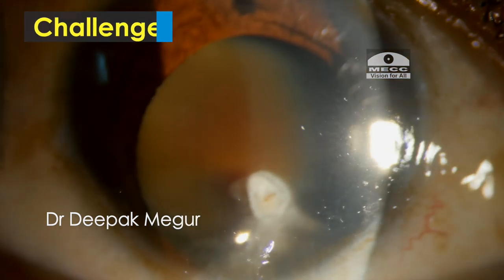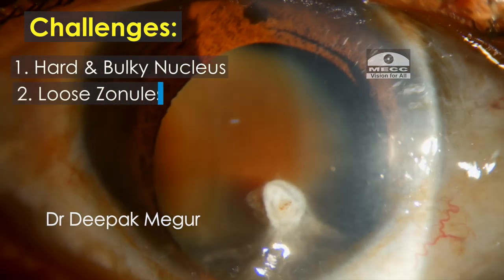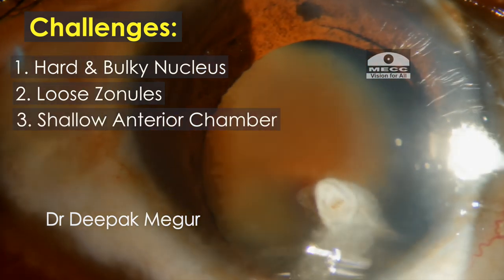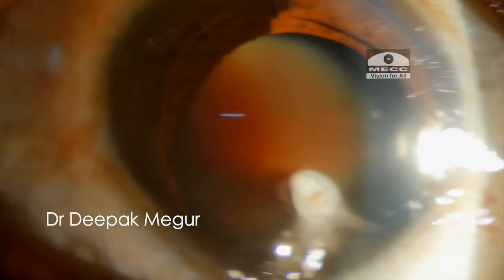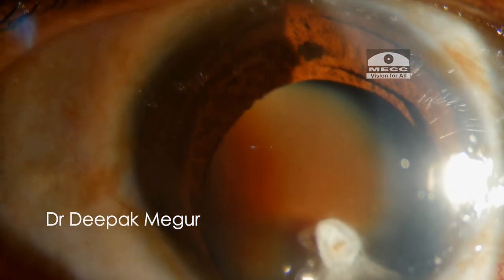So I have multiple challenges to deal with in this case. The lens is quite hard and bulky, loose zonules are to be expected, and we have a relatively shallow anterior chamber to deal with and a small cornea. There is a lack of space to manage the dense cataract, and to complicate things, this small calcified speck on the anterior capsule is concerning me.